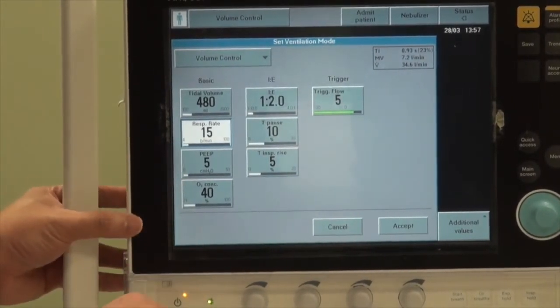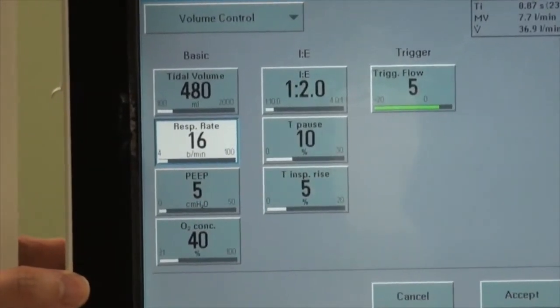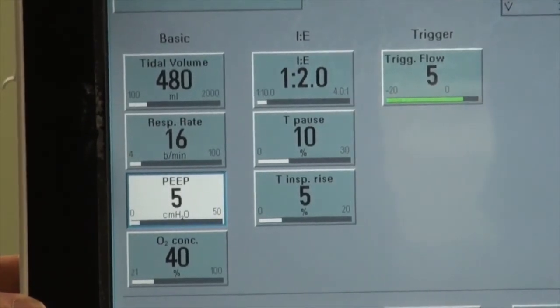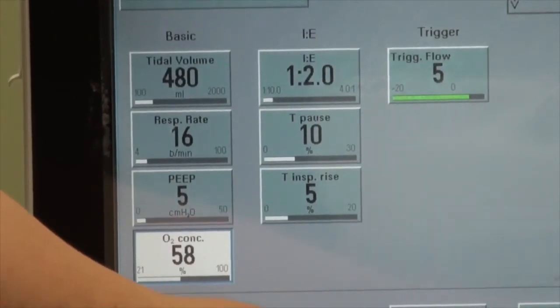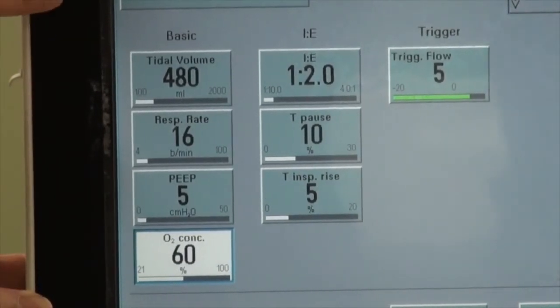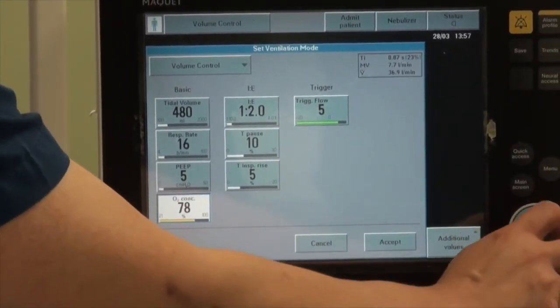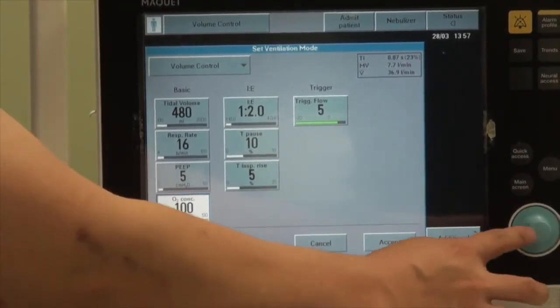For respiratory rate, set it close to what the patient was breathing prior to intubation. Next is PEEP — generally start with at least a PEEP of 5 for most patients. For inspired O2, start off with 100% oxygen. At a certain point, an alarm may pop up indicating a relatively high setting, but you can continue turning the dial to the desired oxygen level. Once you are happy, press down on the dial to select it.